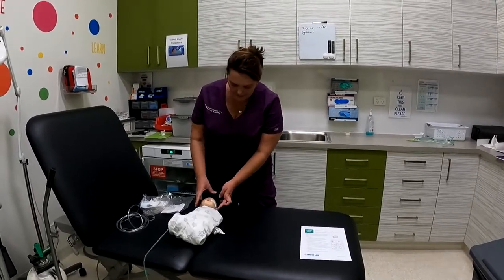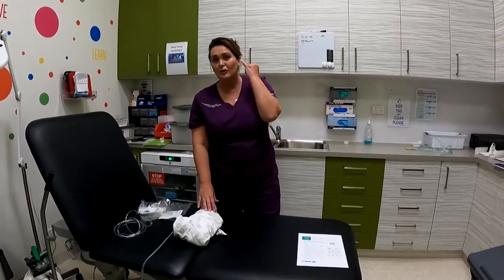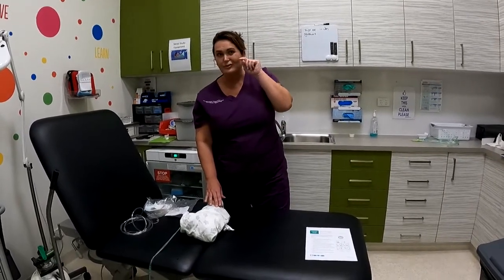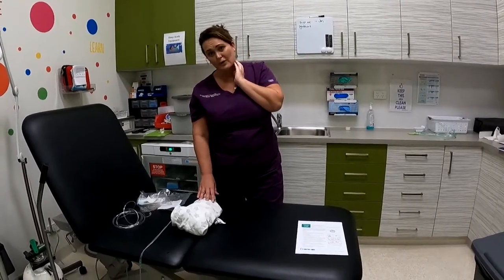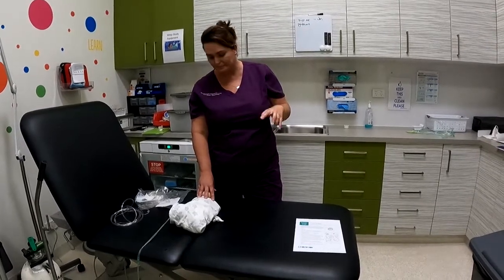When you lift the oxygen taping off, when you're changing the prongs, it's not uncommon to have a little red area underneath, and that's fine. It will heal. You just want to make sure, if you can, maybe move the tapes around a little bit just to give their skin a break. If you have any worries at all with that though, just please don't hesitate to call me.